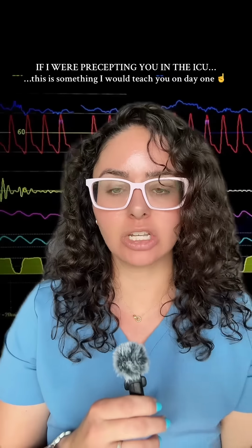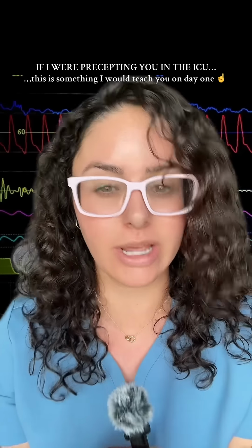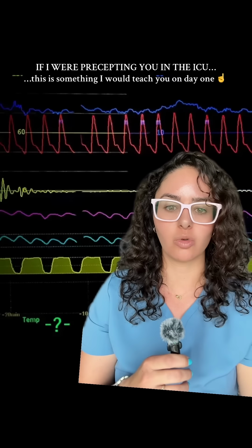If I were precepting you in the ICU, this is something I would teach you on day one of orientation. You are getting a report on your patient in the morning and you're going in and taking a look at your patient with the offgoing nurse. The first thing I want you to do is go up to that patient's monitor and check all of their alarms and parameters.